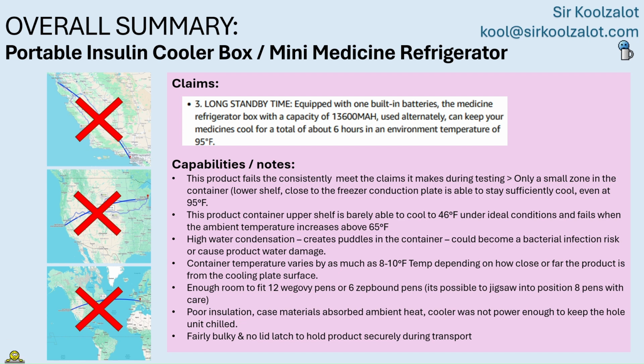Perhaps if they wanted to improve this design, improving its insulation would be highly valuable, making the temperature within the container more consistent throughout, maybe using some thermal conduction rods or cases like aluminium. I don't know, it might help, but in any case, I don't know if they'll even look at trying to improve the design, but it had a lot of potential.